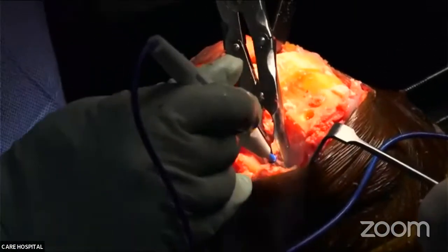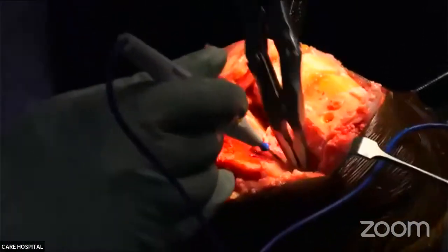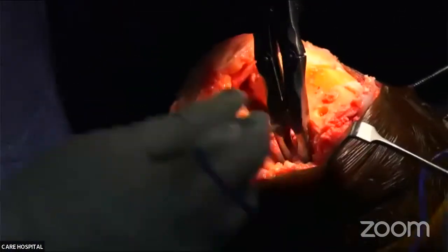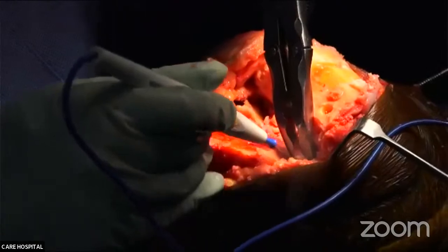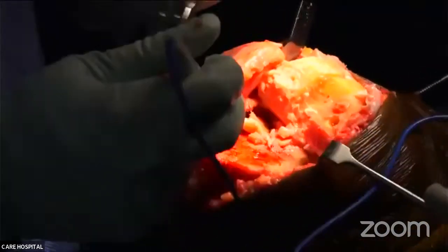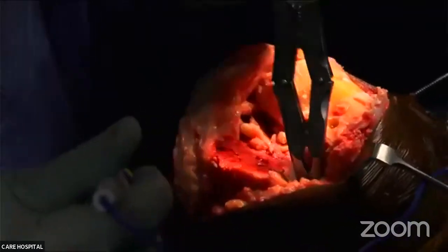Shekhar bhai, on the X-ray you can see that there was a spicule on the medial side. You have to be very careful that you don't damage the medial MCL.